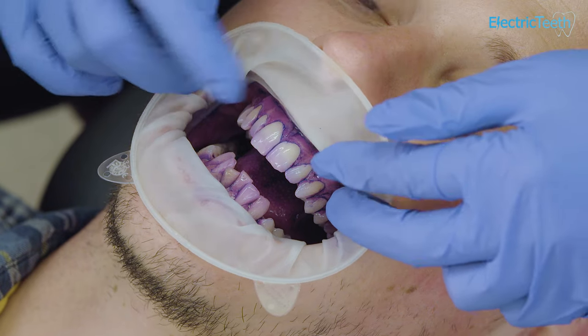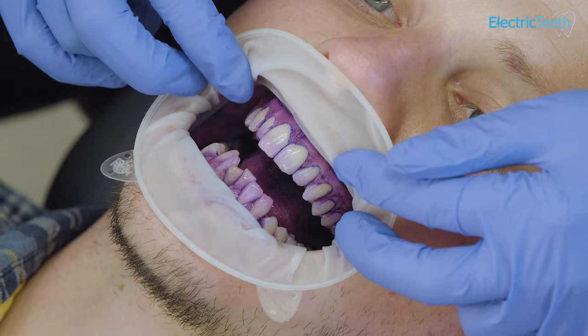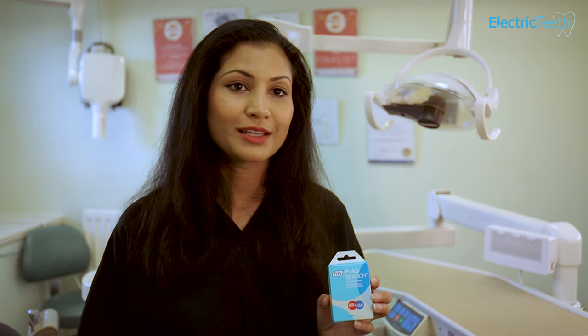So if you were to floss, that would be nice and clear and you'd be removing that debris from in between your teeth — that would be nice and white then. Don't worry, it does come away, so you won't be walking around with red or blue teeth for the rest of the day, and this is great for adults and for children to use to indicate areas that you're missing when you're brushing your teeth.